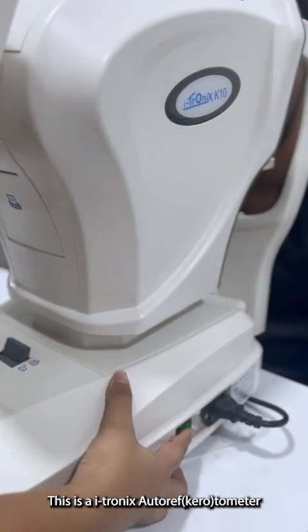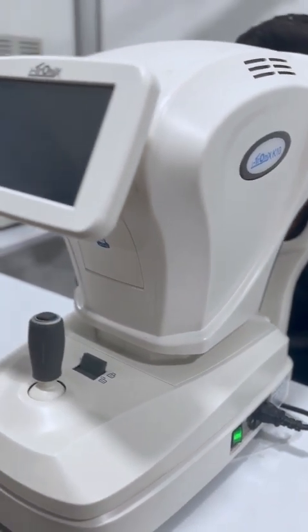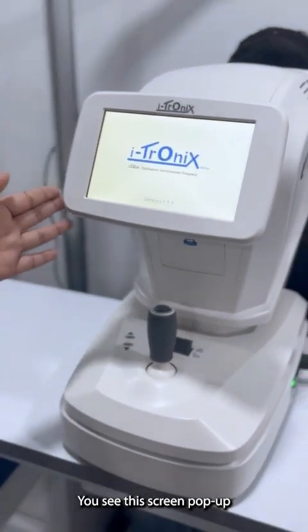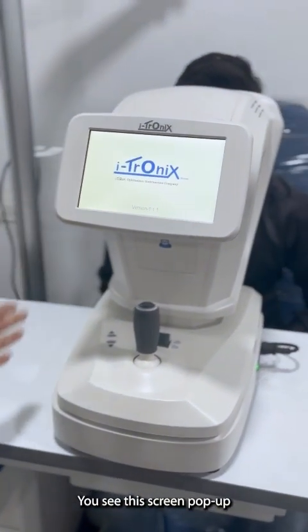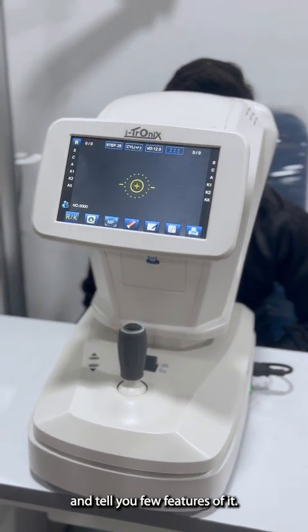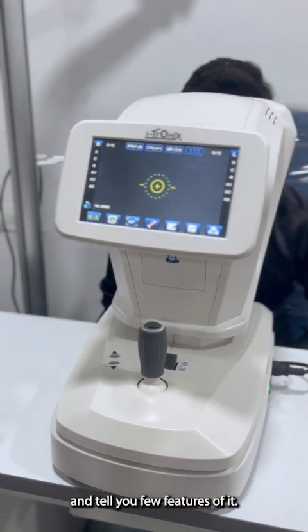This is the iKronix autorefractor keratometer. As we turn it on, you will see this screen pop up and I will tell you a few features of it.